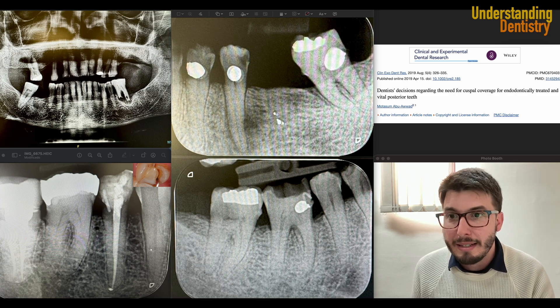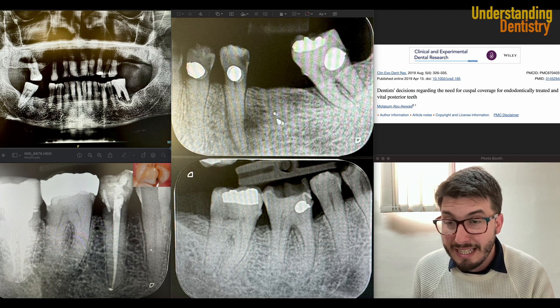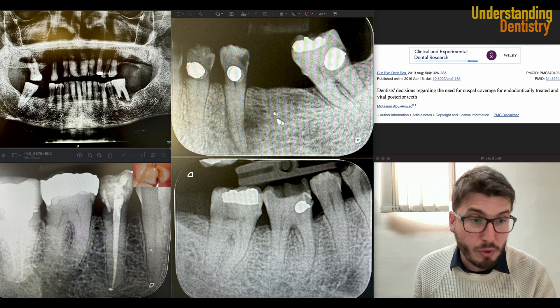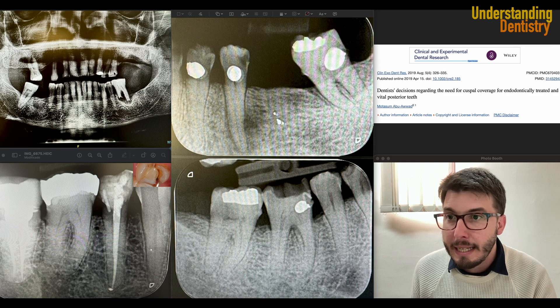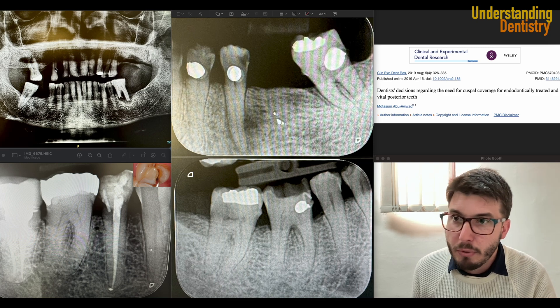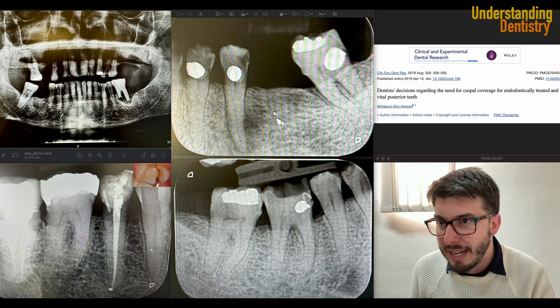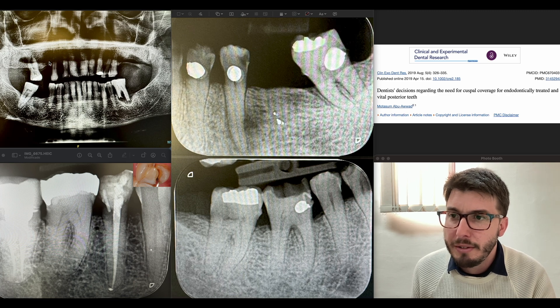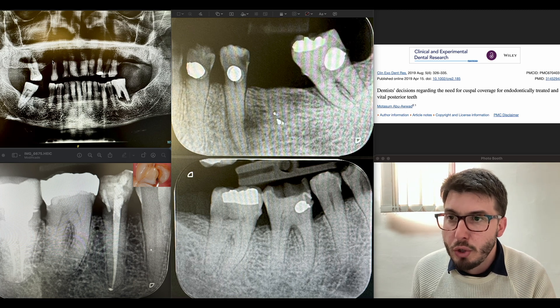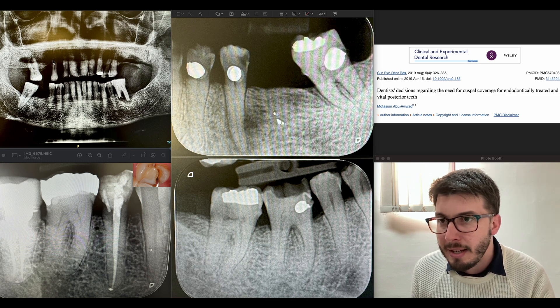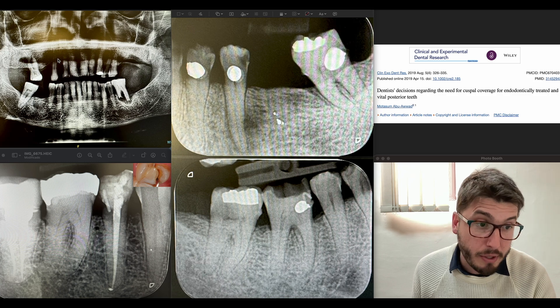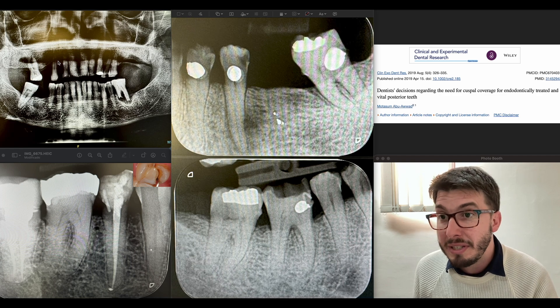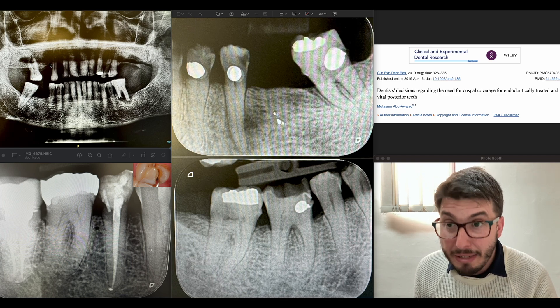There is even root resorption — especially the mesial root — and we need to do something about this. So extraction here. And then this could be the premolar or the canine which is displaced. This tooth in the upper right quadrant has a huge horizontal bone defect — marginal bone loss up to the apical third of the roots. What is the predictability of this tooth? We have to rehabilitate this case.